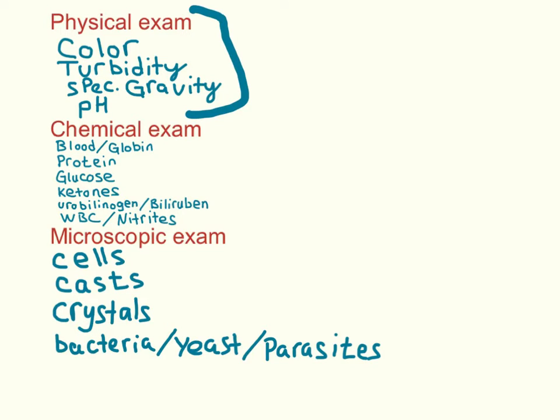Now, some texts will actually add smelling to this. You want to smell it? I don't know if a lot can be gained from that. What you're going to see, though, here in a minute is that some of these chemical tests can actually have false positives. And so smelling this, if it's putrid, you can kind of increase sensitivity and specificity.